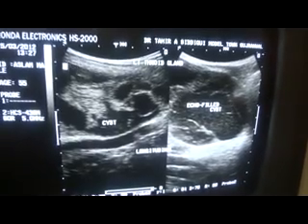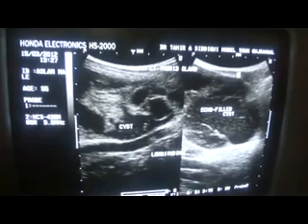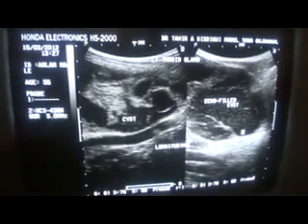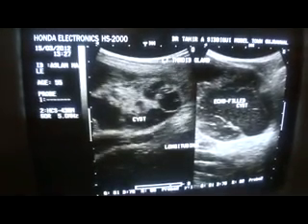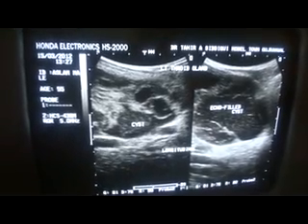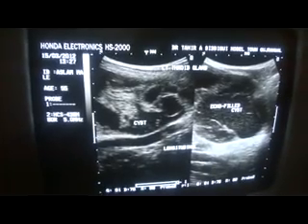This ultrasound was performed without any history, clinical examination notes, or any other investigative procedure whatsoever. In our society we really have to rely upon our own clinical knowledge and the experience we have gained in sonology. To summarize, the findings in this single patient are: number one, medullary sponge kidney; number two, chronic liver parenchymal changes; and number three, this complex cystic area replacing the left lobe of the thyroid, almost in total.